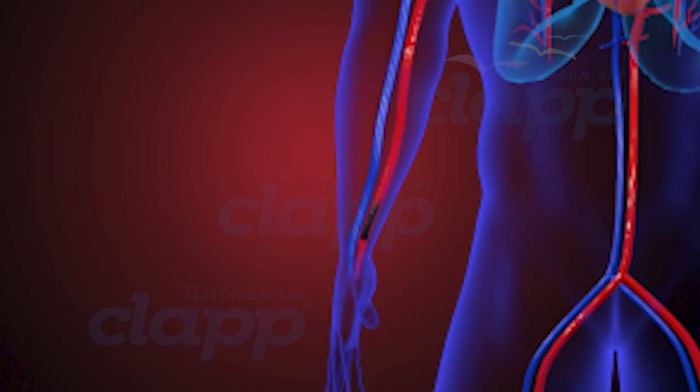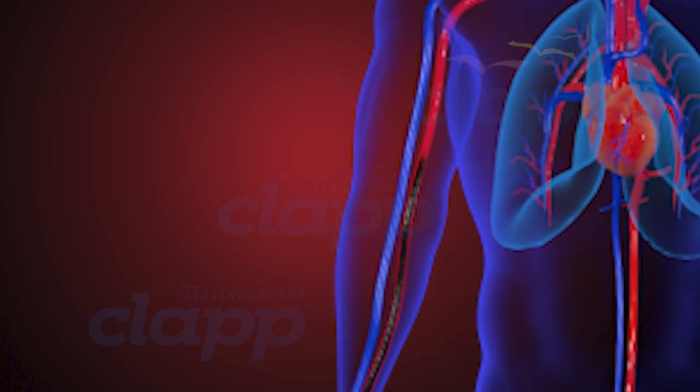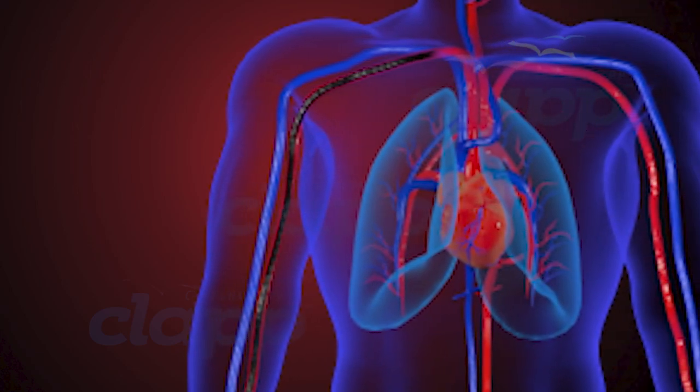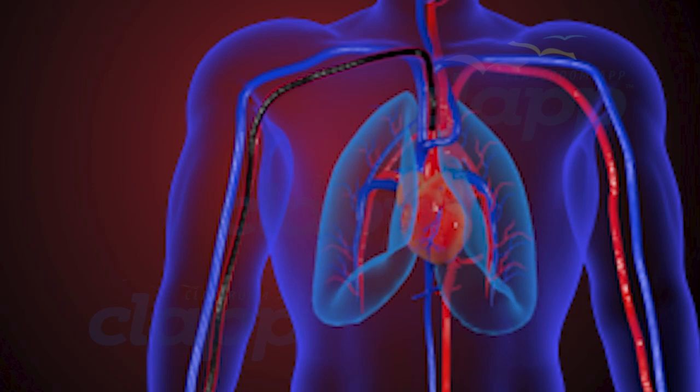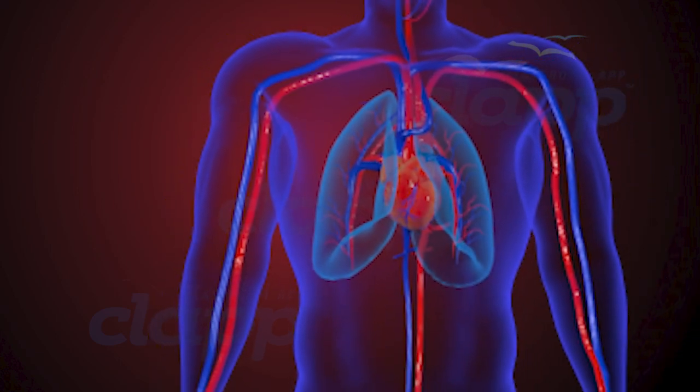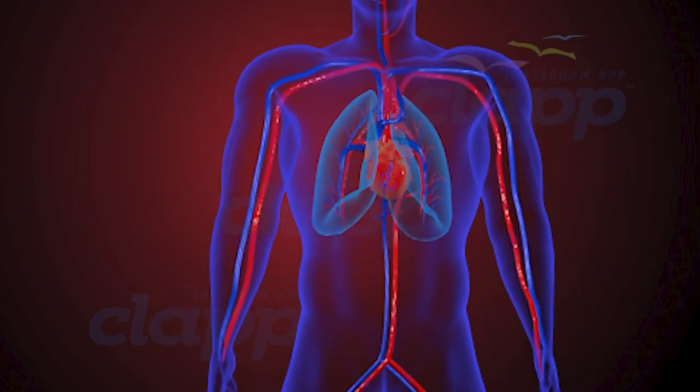Angioplasty begins with the careful insertion of a catheter, a slender tube, into the bloodstream. This catheter becomes the vehicle through which medical professionals navigate the arterial maze to treat blockages. The journey starts with identifying the optimal entry point for the catheter.